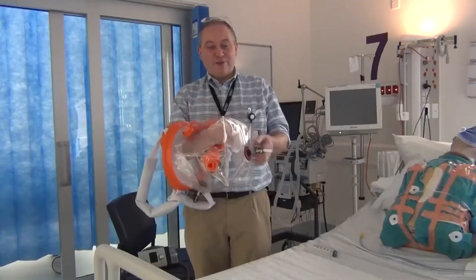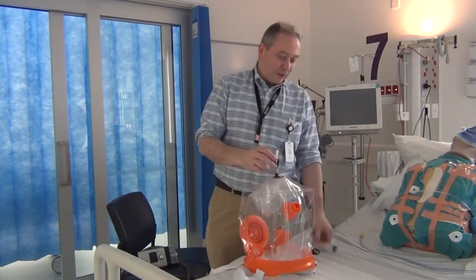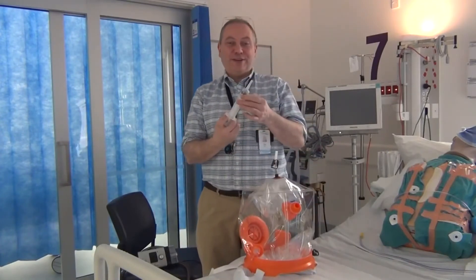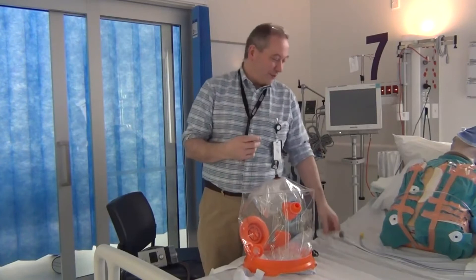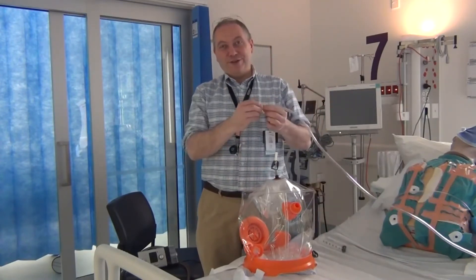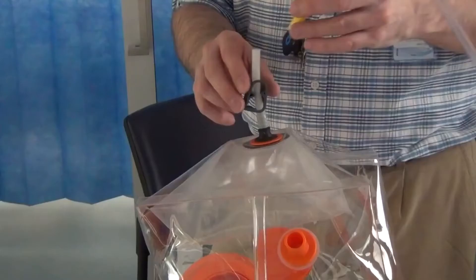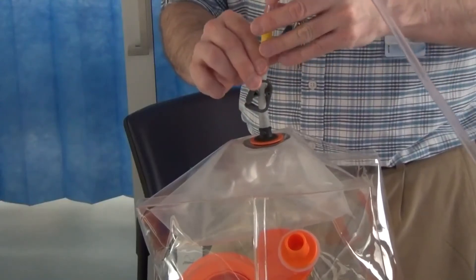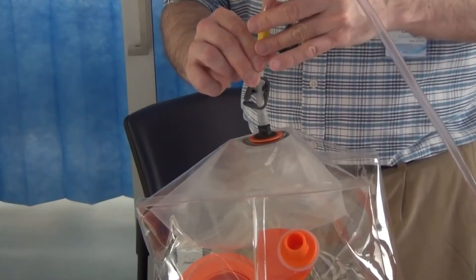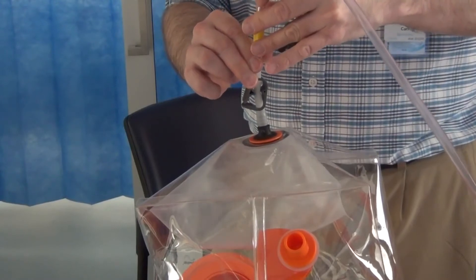I'm now going to demonstrate the filling of the air cushion. We can do this with a catheter tip syringe. However, it's easier and faster to use piped air or oxygen from the wall source. If we just watch the cushion here, I will connect this to my wall source of oxygen and we should gradually see the cushion inflate.